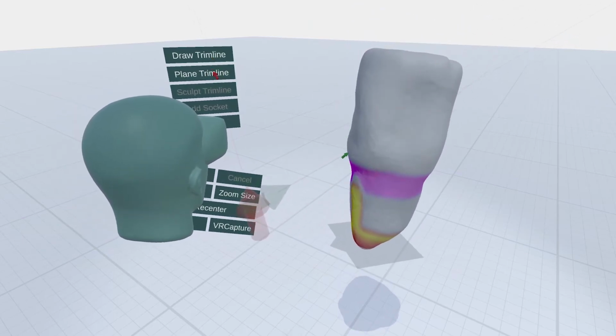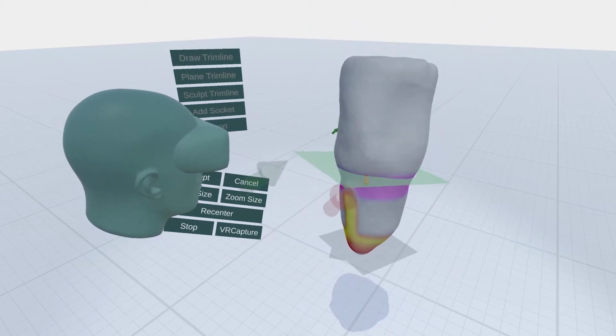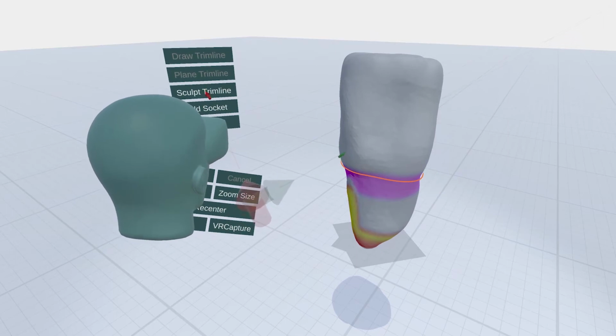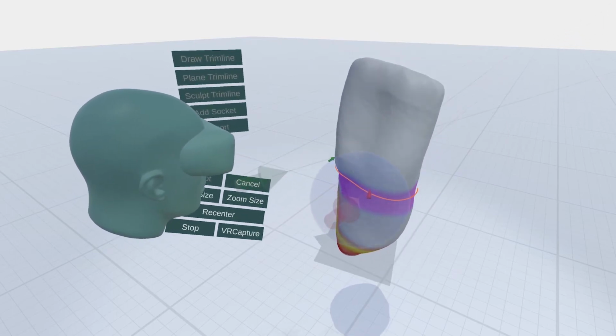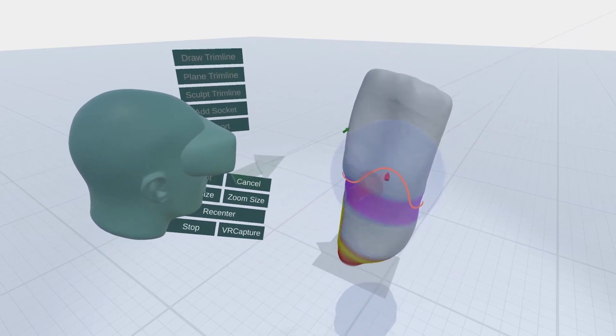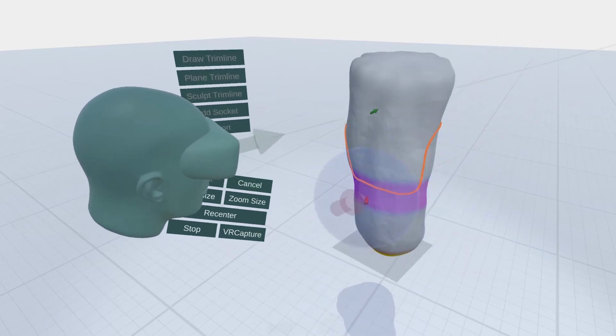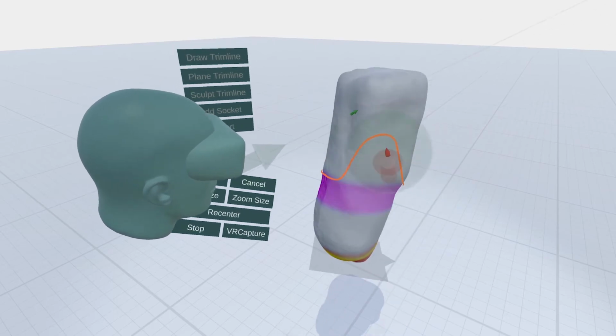The prosthetist specifies the trim line with a curve on the base surface. In our system, we initialize the curve using a cross-section plane, and then a brush-style interface is used to sculpt it into the right shape. Much like other VR sculpting tools, we have found that this interface is immediately understandable to users who are not 3D experts.